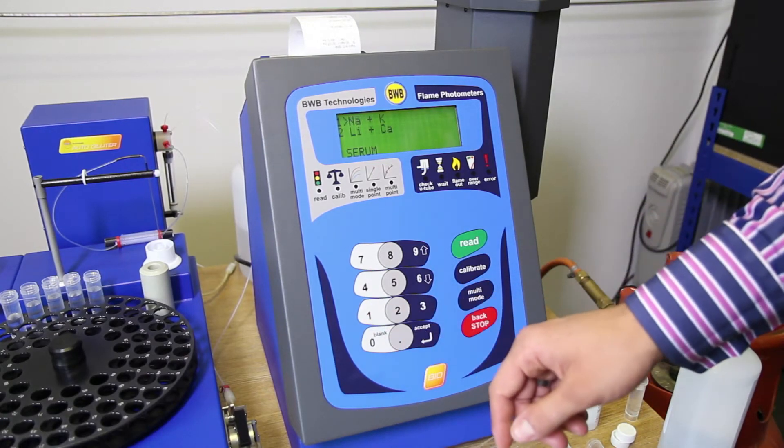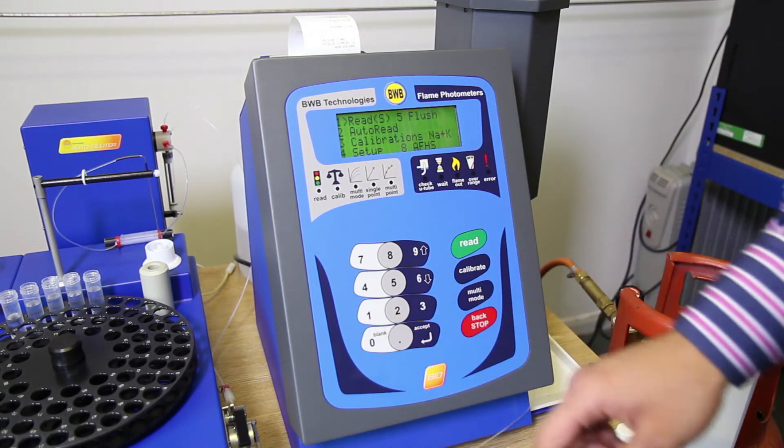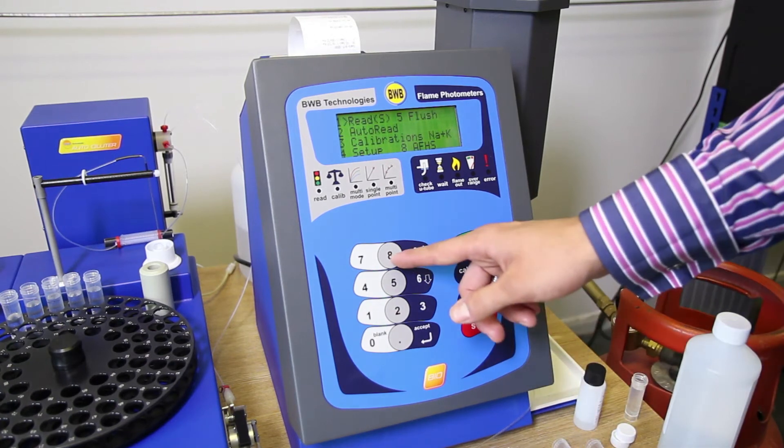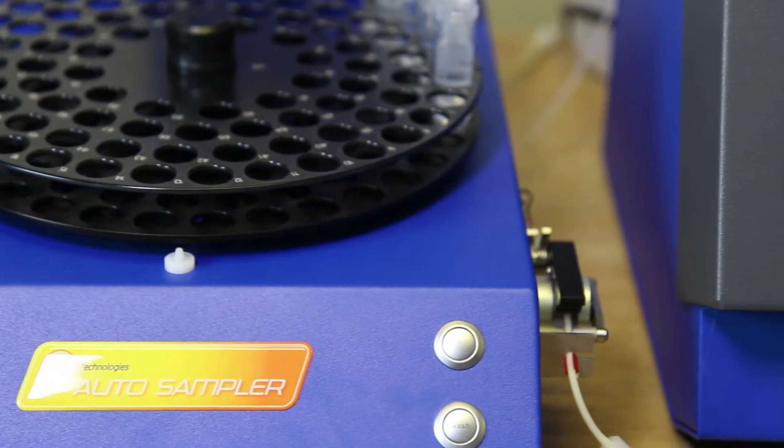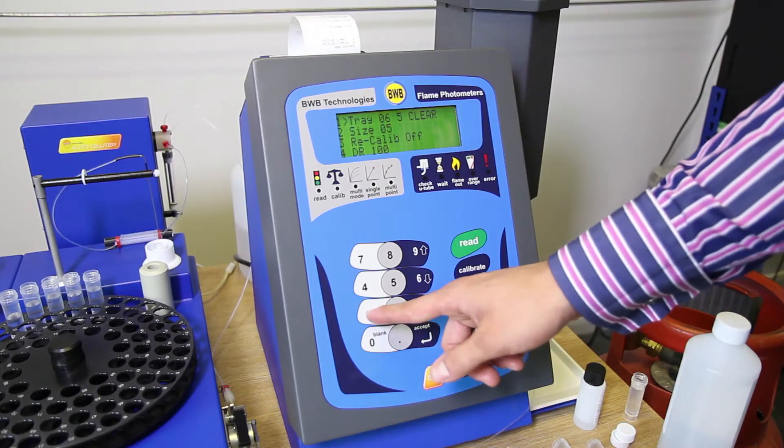From the main menu select serum or urine and your ions of interest. Select number 8 AFHS. Note AFHS interface must be on. Now choose tray setup.